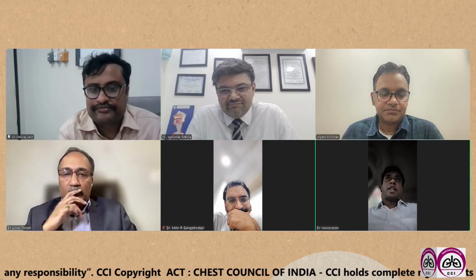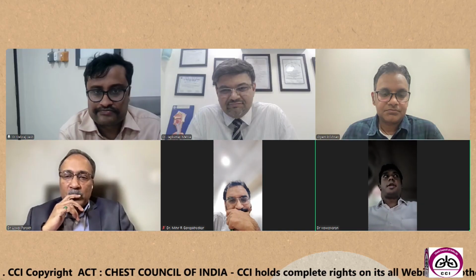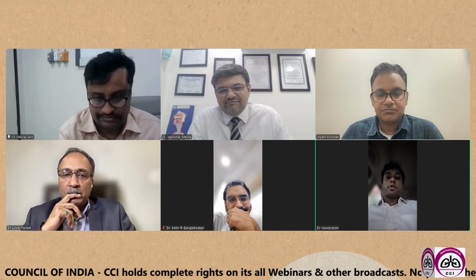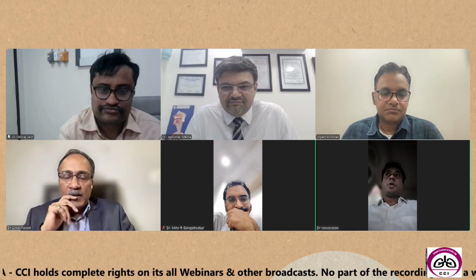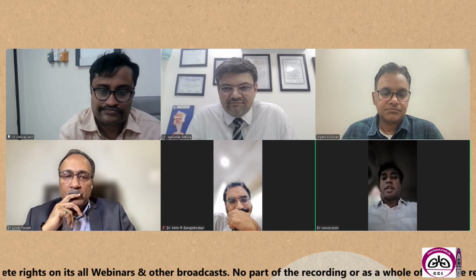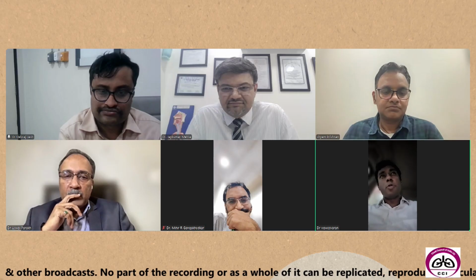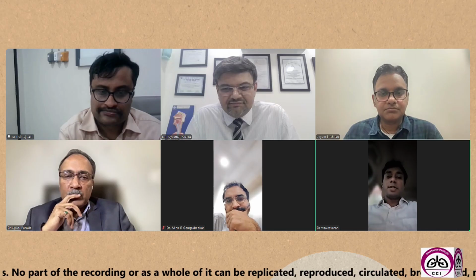So EBUS is the easiest of all the interventional procedures to learn, and there's nothing to be scared about in doing an EBUS. As I said before as well, the only thing you should be scared of is how to protect your scope from needle damage, because it's a very costly scope to handle. But the fear of doing should never stop you from doing it. I think it is a very easy procedure to do, and once you have a good proctor and a mentor to teach for 1 to 3 months, I think you should be really good enough to start doing an EBUS.